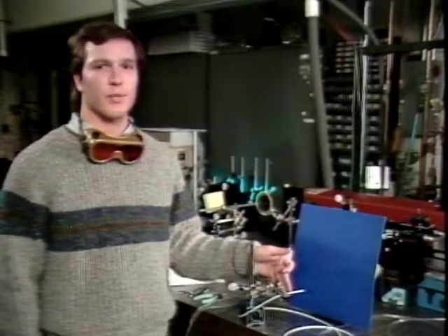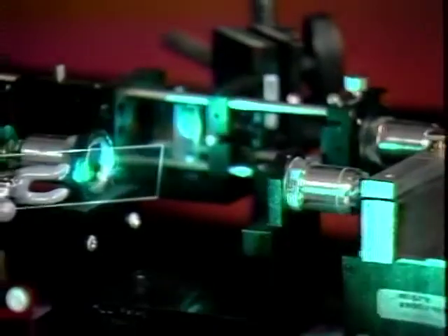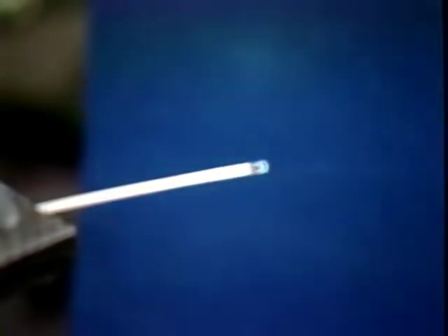We then set the laser power and exposure time by the computer. With the spot diameter, laser power, and exposure time, we can deliver our photon dose and remove a very precise amount of tissue. Each optical fiber is fired individually, creating its own unique nibble. The nibbles are combined to create one large composite hole through which the catheter can advance.